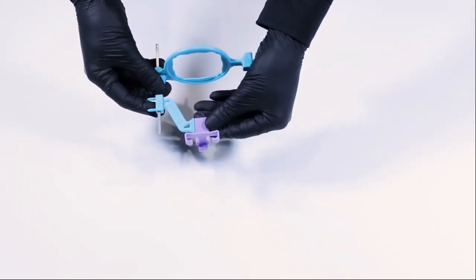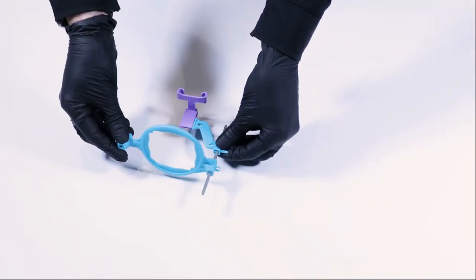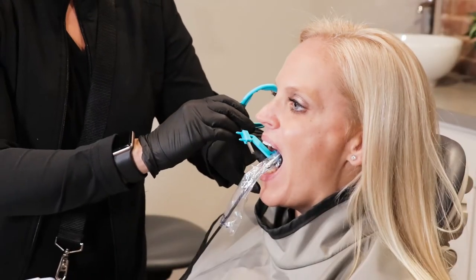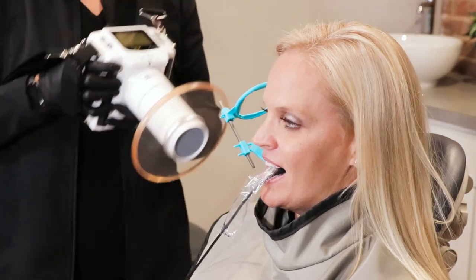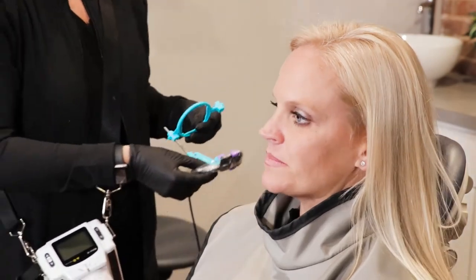Make sure the cord is directed out of the mouth, not towards the throat. You should be able to see the sensor directly through the ring. Our x-ray positioning system is set for the upper right PA. Place the sensor on the lingual of the upper molars. The sensor will tilt towards the center of the palate. Have the patient bite down. Make sure the ring is as close to the cheek as possible. Place the x-ray cone up to the ring, then expose your x-ray.